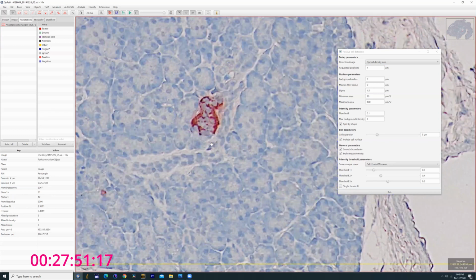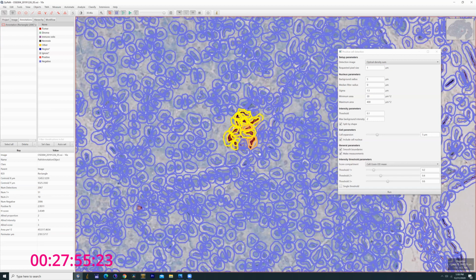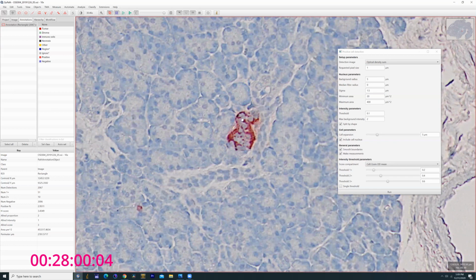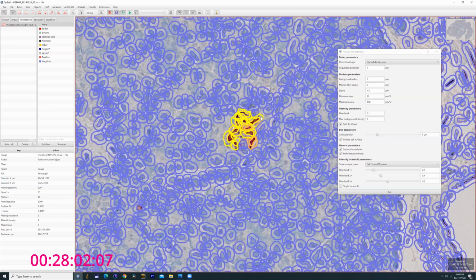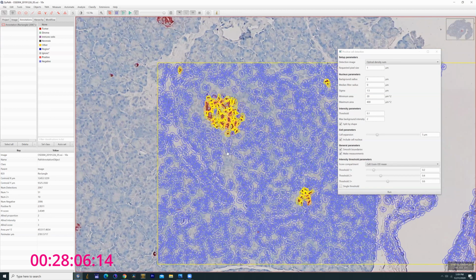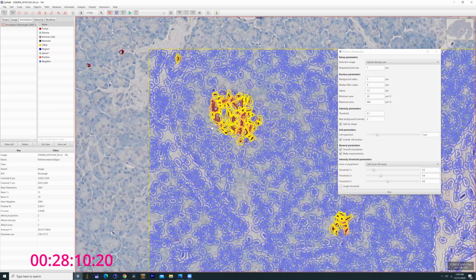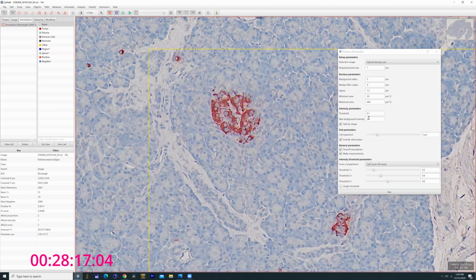I see two things. I'm looking at this piece of an islet, and the brown is denoting the insulin staining within. It's not a particularly pretty one, but it is a good place to start. And here, let's look at this guy up here. We can see two things for our initial guess. The first thing is we're losing some of these nuclei from the H and E, or actually a little bit on the faint side. So we can push this down to say, let's try 0.05.